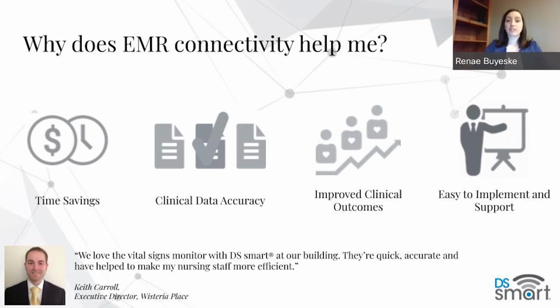We have four main benefits as it relates to EMR connectivity and connecting your information directly to the electronic medical record. First and foremost, with all of those challenges we just spoke through, time savings. Being able to take that time and put it back into our caregivers' day to do things other than sit behind a computer or stand at a kiosk and read over paper and manual documentation, typing that information in. Being able to put that time back in the day to provide different care that we need to for our residents.